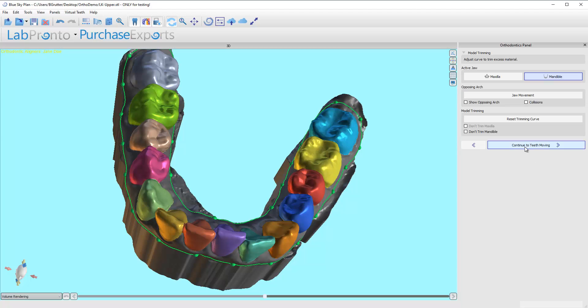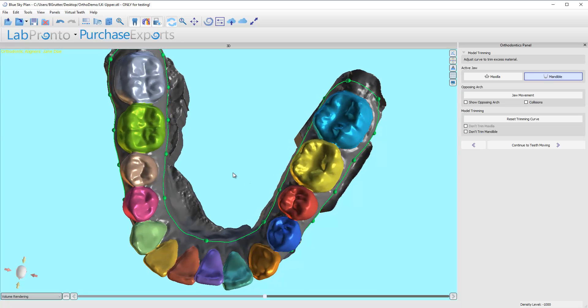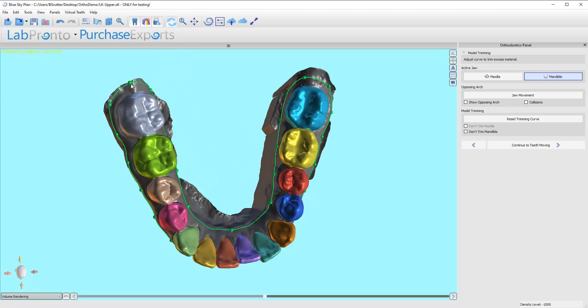We're done, and that's how quick this step is. I think that once we get to the point where we are doing this, we might even be able to bypass this step almost entirely — so that's maybe just a little preview of something to come in the future. I'm going to click here to continue to the tooth moving.